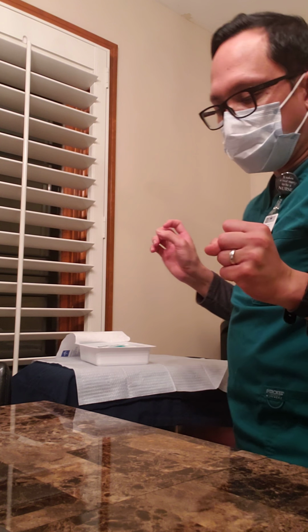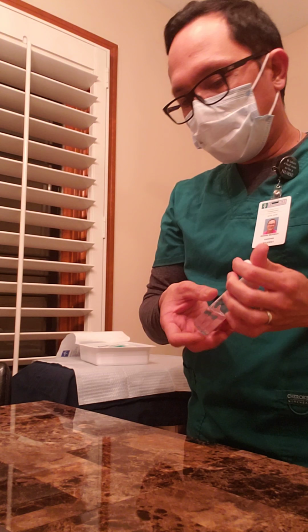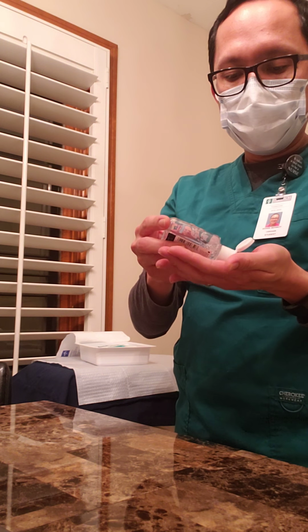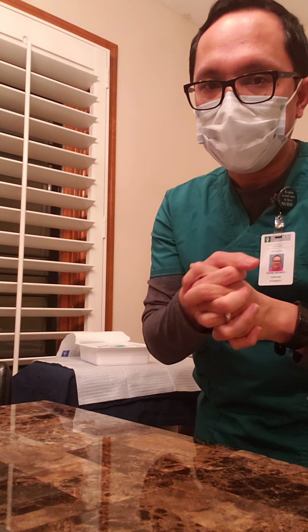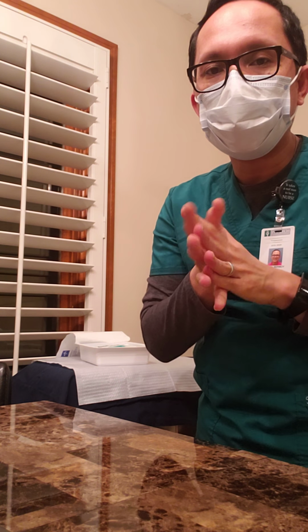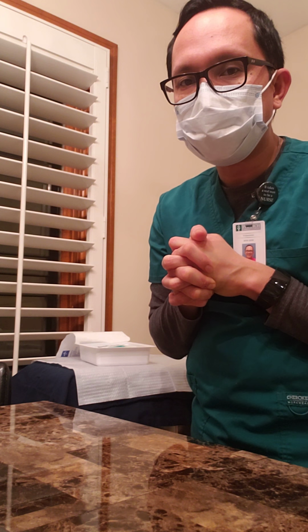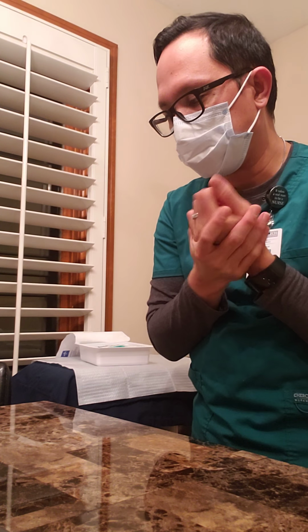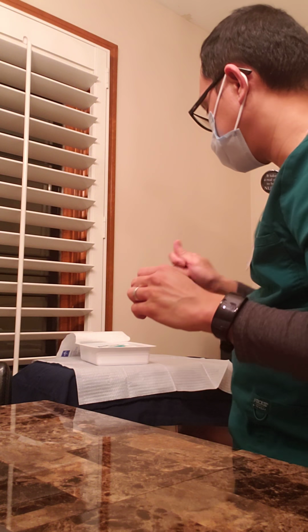Before you clean it, you can also assess or measure the length of the catheter. Make sure you document it, and then compare it to the previously documented measurement just to see if there's any migration of the catheter into the veins or in the skin.